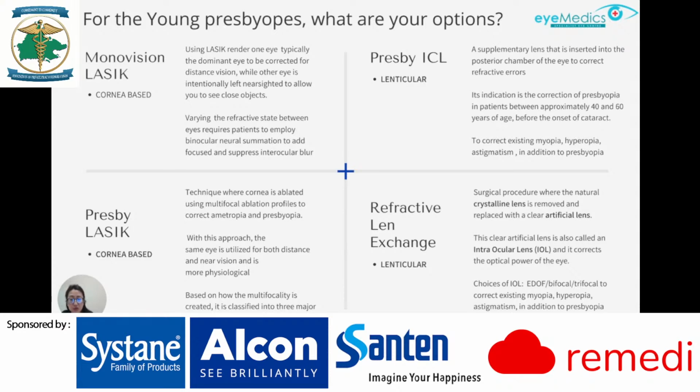Refractive lens exchange is a surgical procedure whereby a crystalline lens is removed and replaced with a multifocal intraocular lens implant, which corrects existing refractive error in addition to presbyopia.